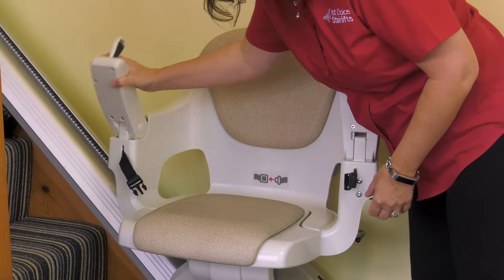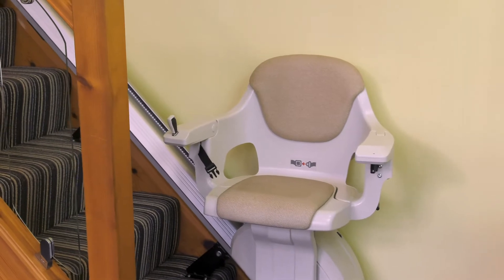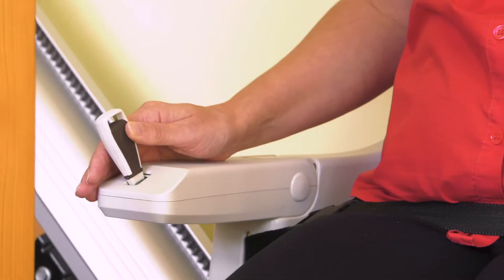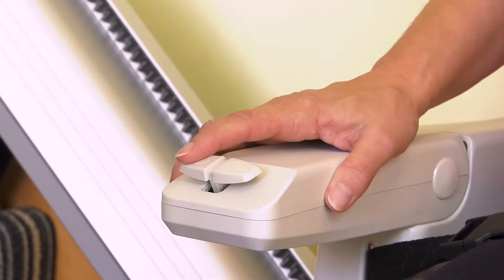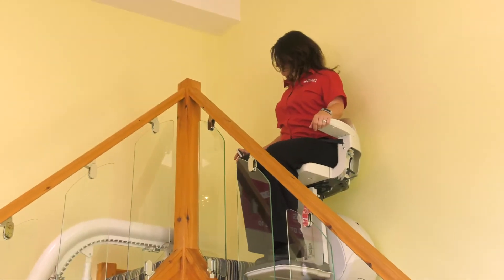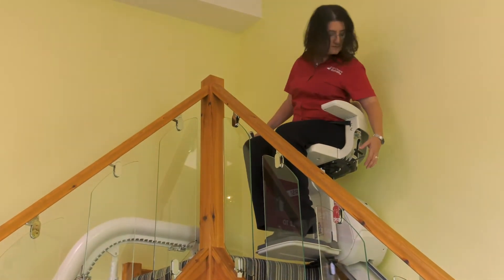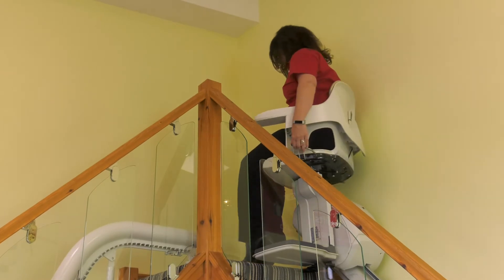When not in use, the chair and footrest fold up, or you can leave it all unfolded and ready to go. To use, simply sit in the seat, fasten the seat belt and press the arm control in the direction of travel with constant pressure. You have a choice of a joystick or rocker arm control as standard. When the lift reaches the end of the rail, it will stop automatically. The chair swivels around at the top and this is operated by a manual lever at the side of the chair.